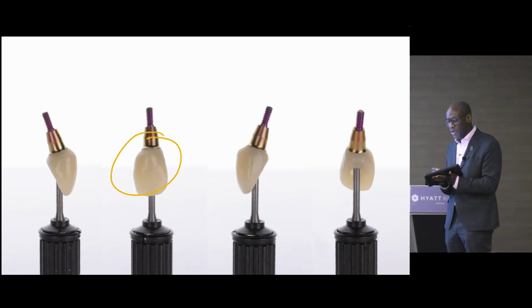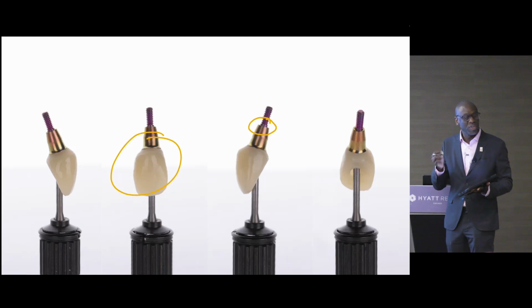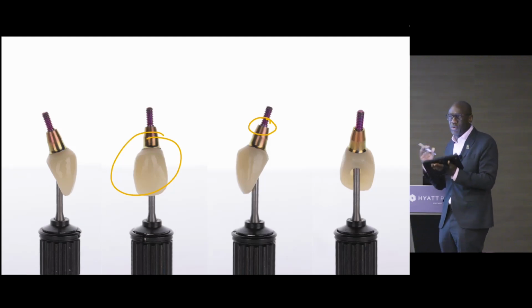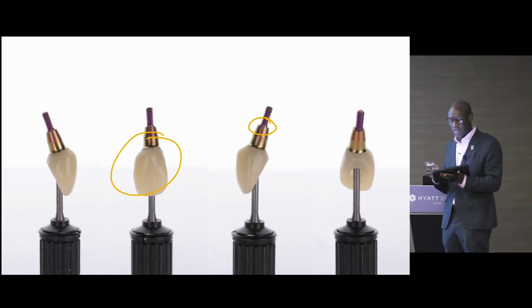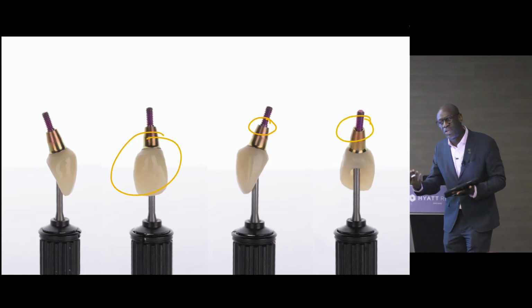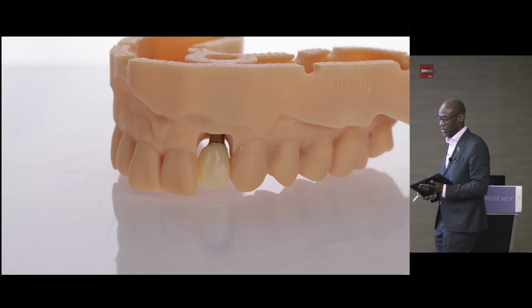pre-made crown. You'll notice also we've used the non-index version. This means that if I have a small issue with timing and depth, I don't need to pull the implant round anymore. I can just place this on. Now for this particular implant system, you can use non-index and torque it at 15 or 25. We're obviously going to change it to something indexed for the final. And again, there's some subtlety around that we'll get to.